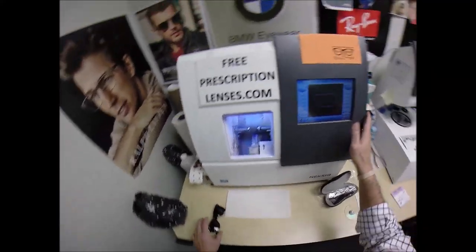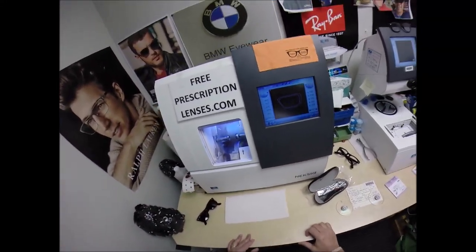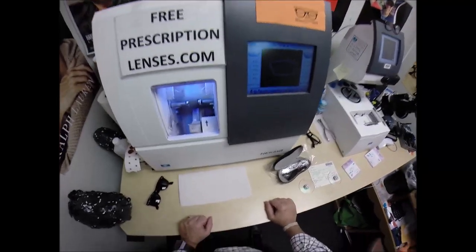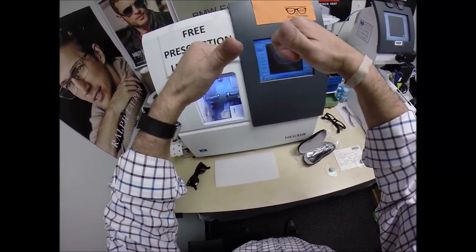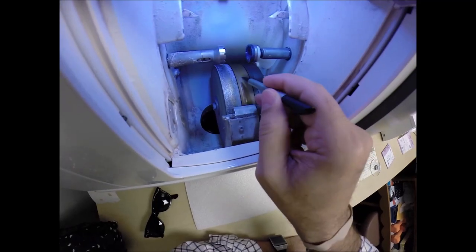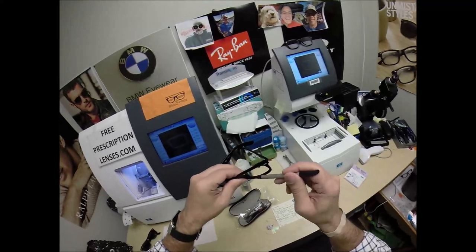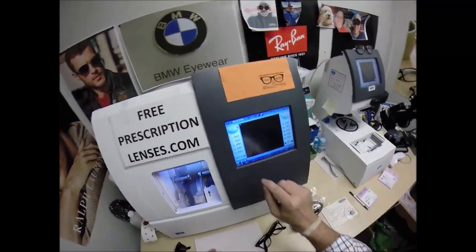Now this is the edger — this is what's going to do all the work while I run my mouth. It costs forty thousand dollars, weighs 200 pounds — I recommend everyone go out and buy their own and put it on your kitchen counter. You will need this guy with the two thumbs and the bad jokes to do it for you. The cutting wheel is this diamond-crusted wheel; this channel is going to put the V-shaped bevel onto the lens so it stays inside the bevel of the frame. Let's go ahead and wake up the computer.